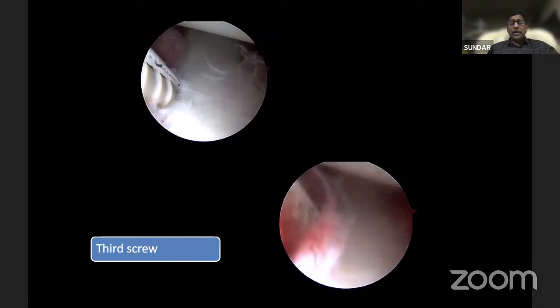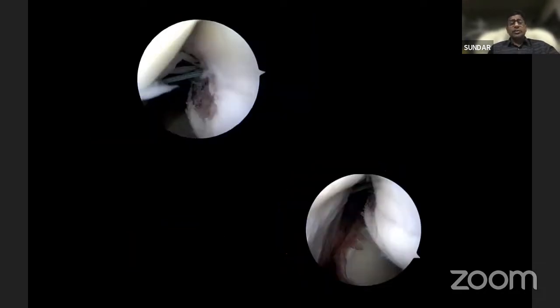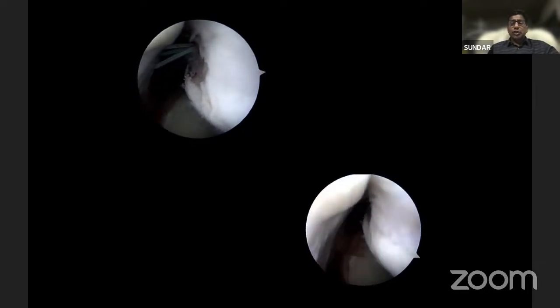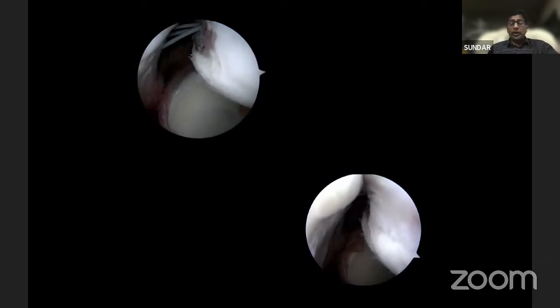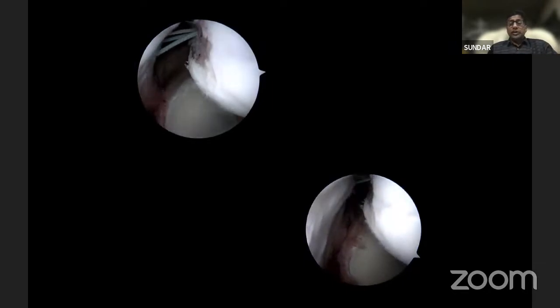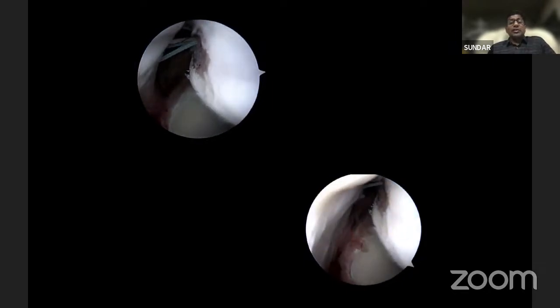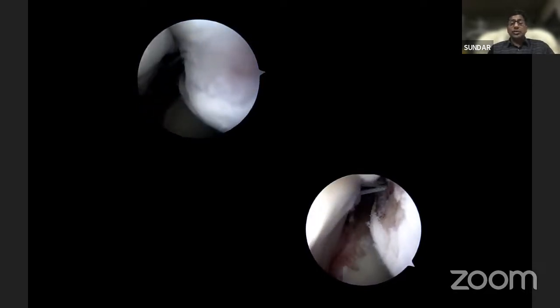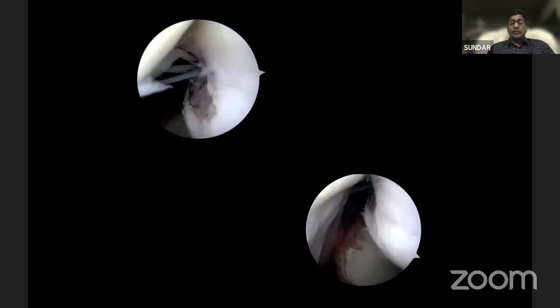Because this patient also had a Hill-Sachs, I did a remplissage. We can see the parachute technique of the infraspinatus with bites on the 4 sides. Once you tie the knot, that will give you posterior support for the humeral head and keep it centered. It also protects your anterior labral repair. So my take on remplissage is that I am a bit aggressive with it in anterior labral tears.